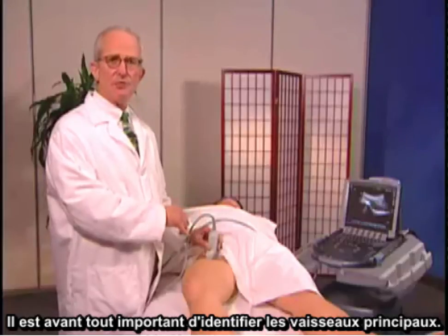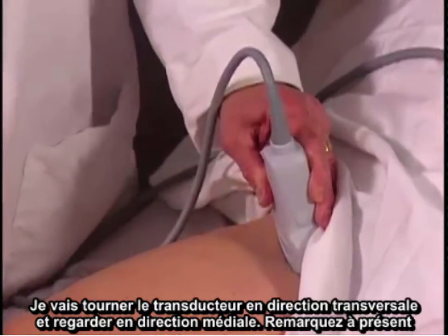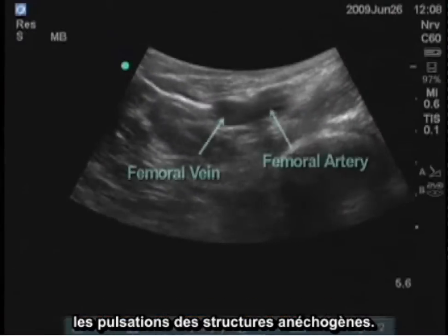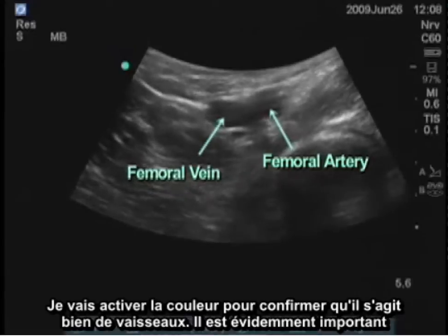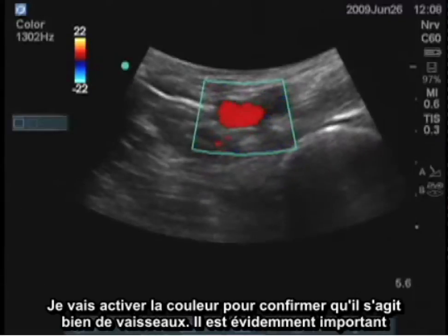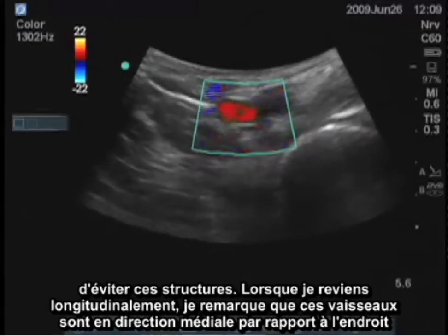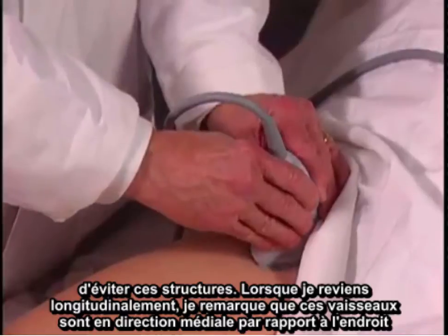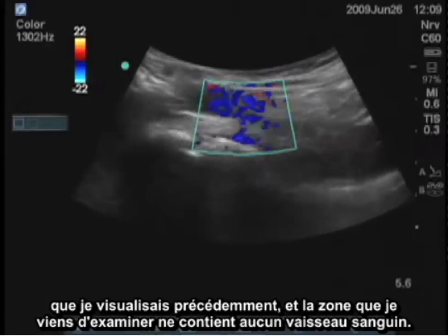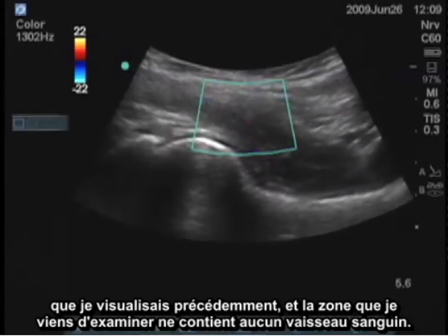Before you do anything, you want to identify the great vessels. I will turn the transducer transversely and look medially, and we can see the anechoic structures that are pulsating. I'll turn on the color. You should be able to confirm that those are the vessels, and we want to obviously avoid those. When I turn back longitudinally, I see that those vessels are medial to where I was looking before, and now that area I've examined does not have blood vessels.